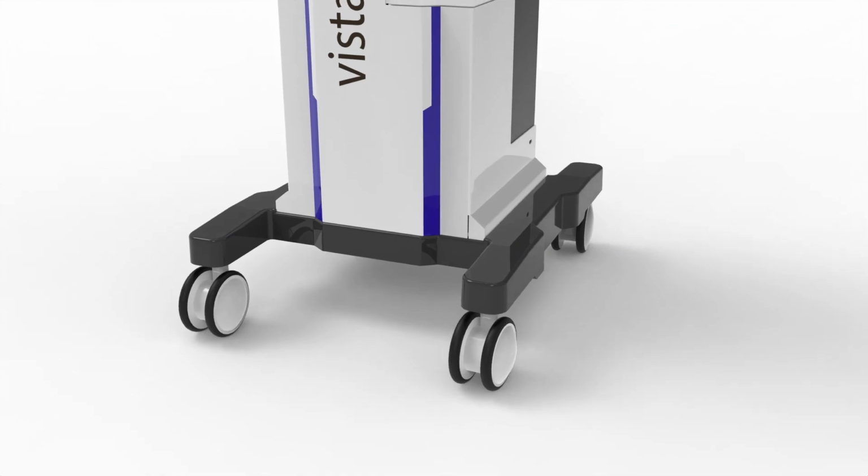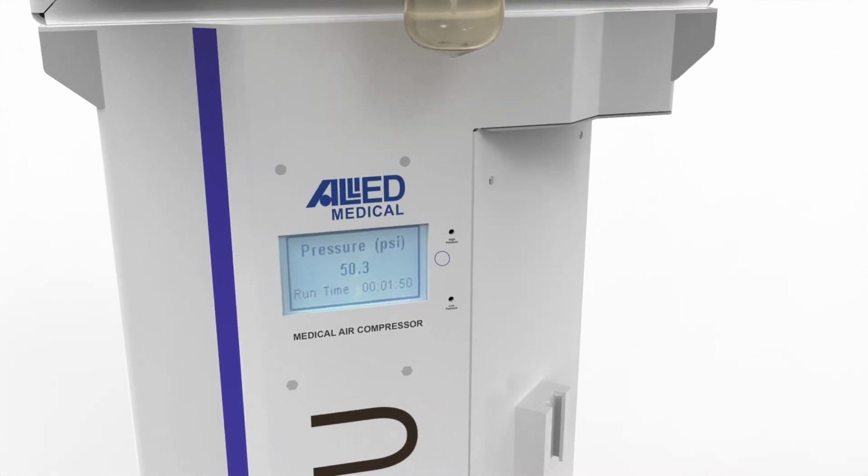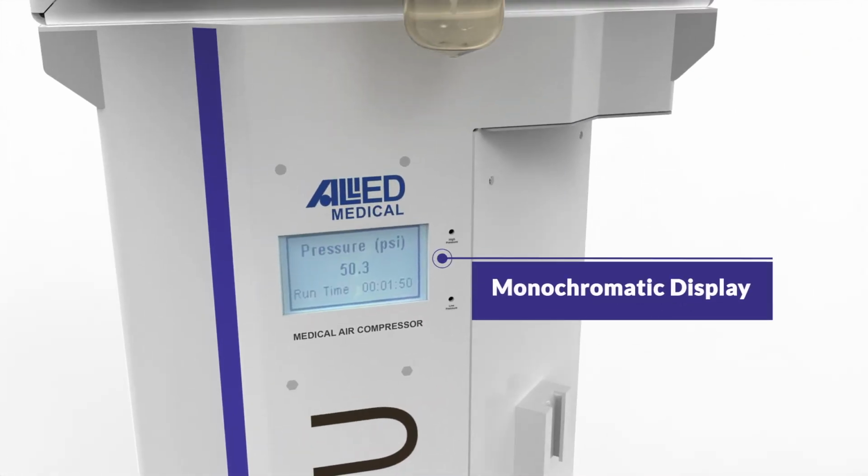On the compressor unit, you'll find a 3.2-inch monochromatic display. This display provides vital information, such as pressure readings, output pressure levels, runtime data, and various alarms.